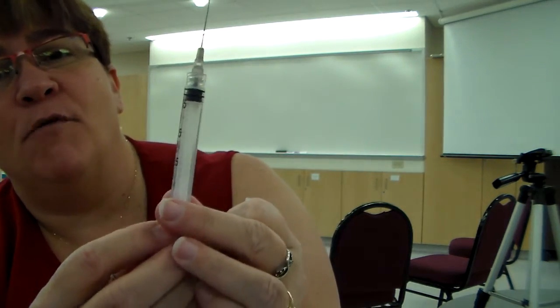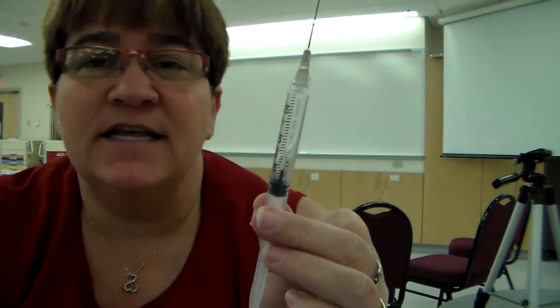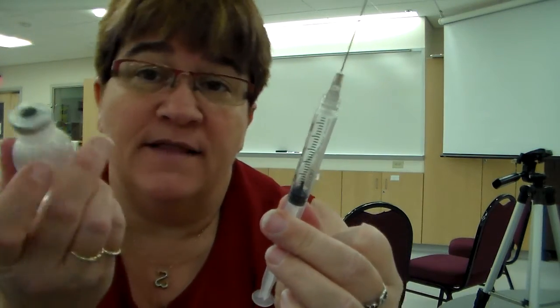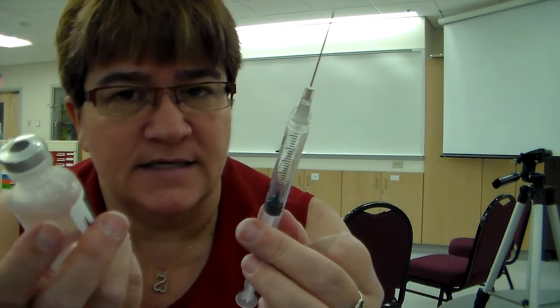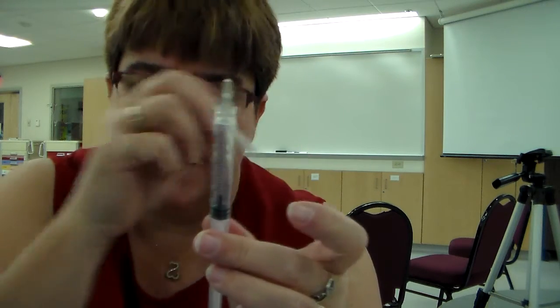Okay, so I'm going to pull back on the syringe till I get to at least the 3 milliliter. Now, it doesn't matter if I put 4 milliliters of air in here if I'm only going to take out 3. No, not really. It doesn't. Okay, you want to do at least 3 milliliters. Okay, so we've got 3 milliliters of air in here.